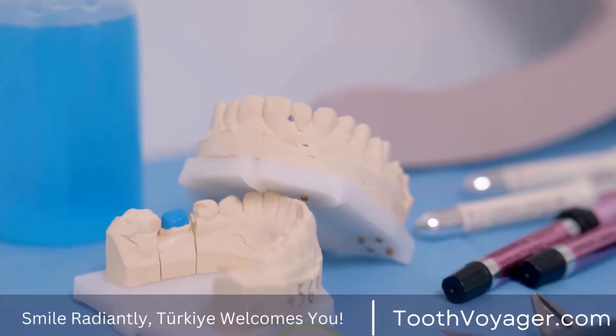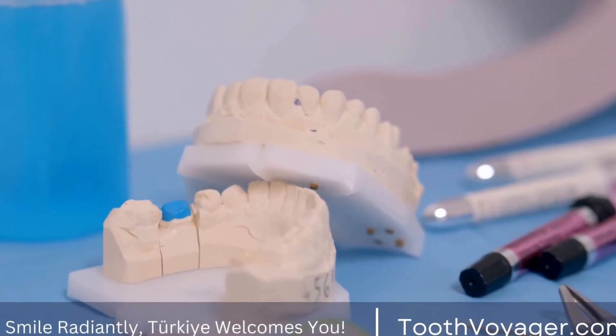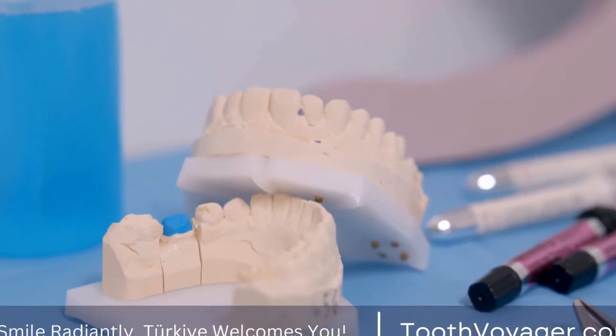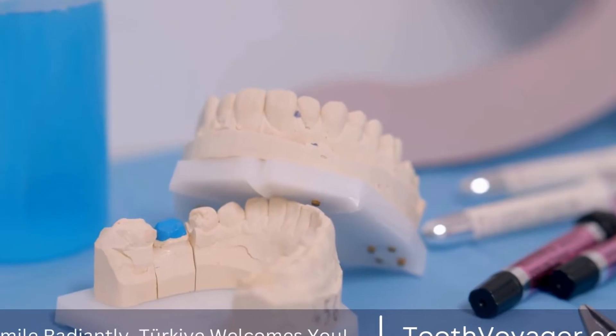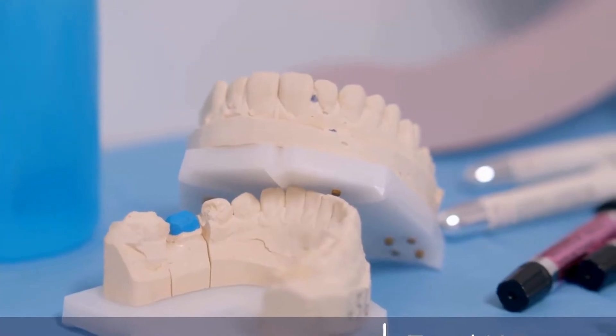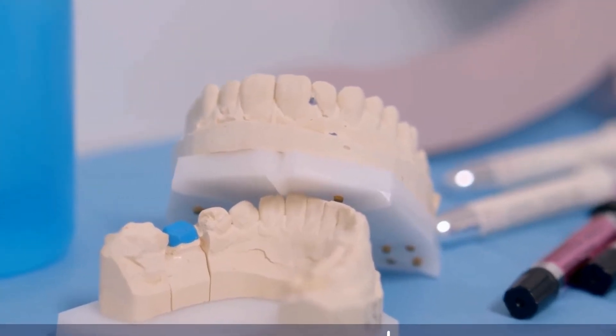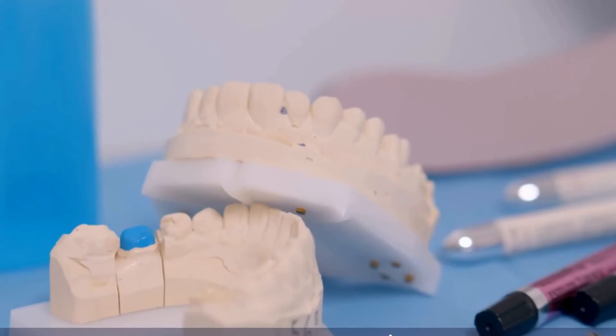In this video, we will outline the step-by-step process of how root canal treatment saves your tooth and why it is important to seek treatment if you are experiencing tooth pain or infection.